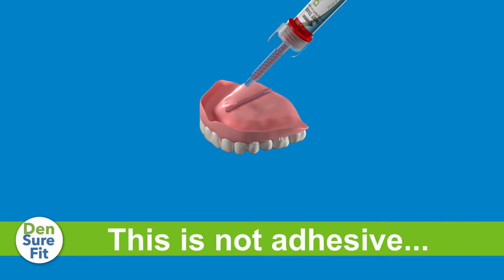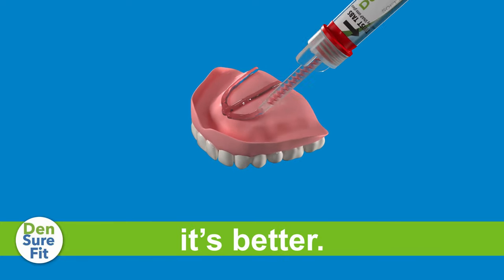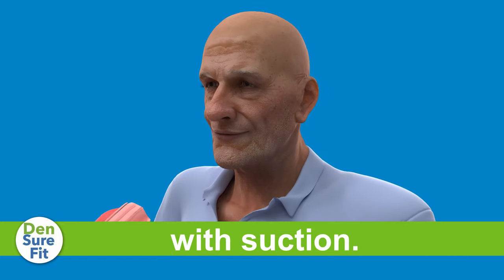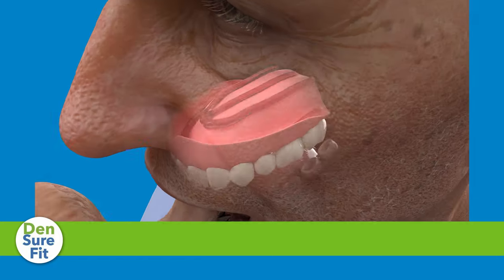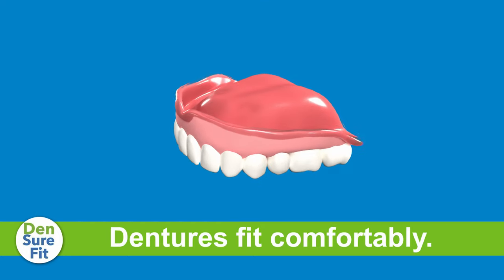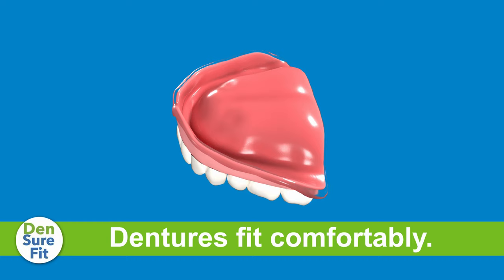Hi, I'm Dr. Rena Judy. I'm excited to introduce you to DenSureFit. It's a soft silicone material that creates a new impression of your gum line on your denture, filling the empty spaces between your denture and your mouth, allowing your dentures to fit properly and comfortably.